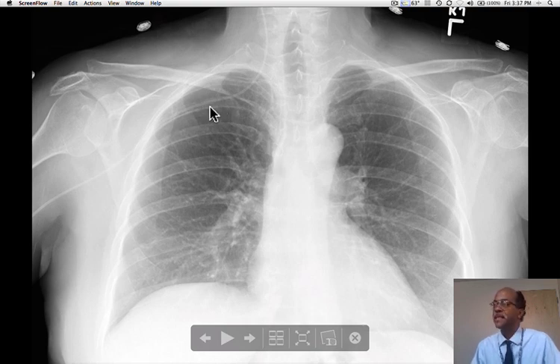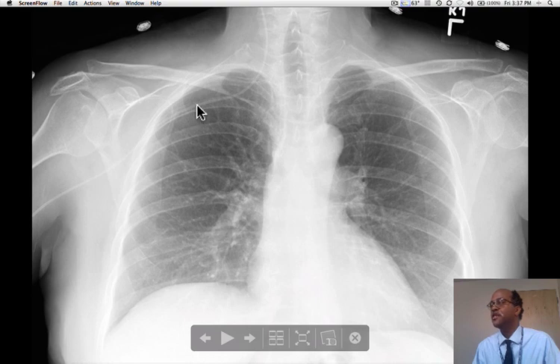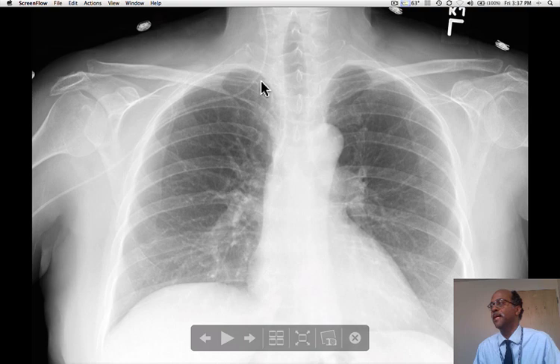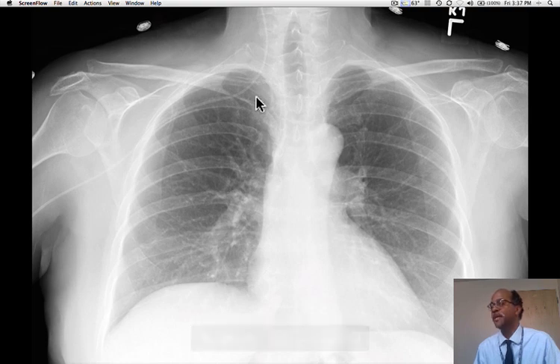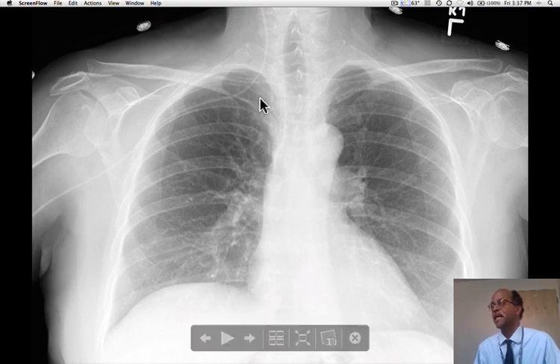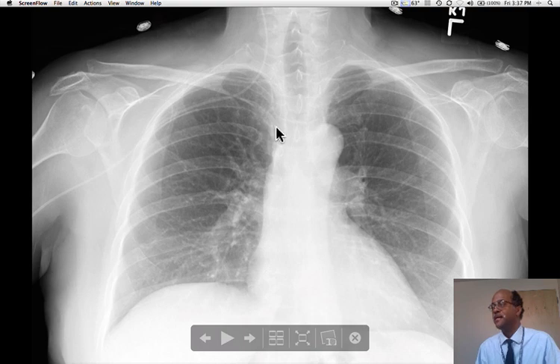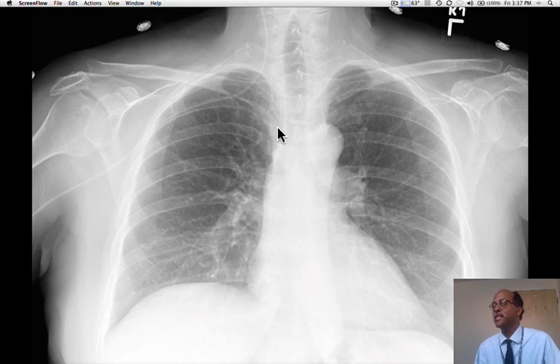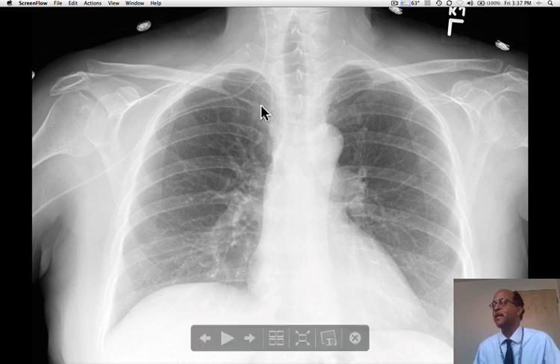So where is this line? It's actually gone up into the internal jugular vein. If we think about it, here is the subclavian vein — it should meet up with the internal jugular vein, and that forms a brachiocephalic vein. That then continues to form the superior vena cava when it meets the left brachiocephalic vein. Knowing how the veins connect, and where they appear on the chest x-ray, is really key. So this is a misplaced PICC line.